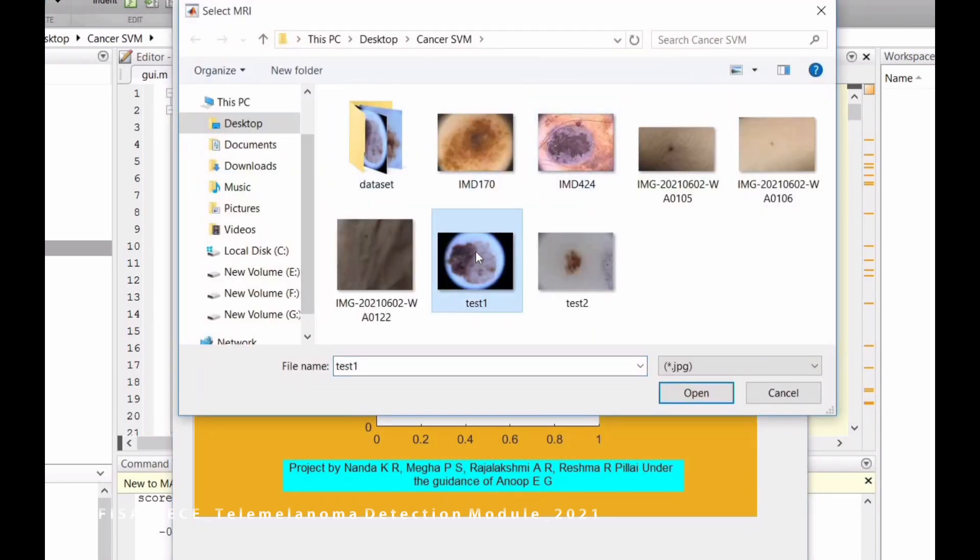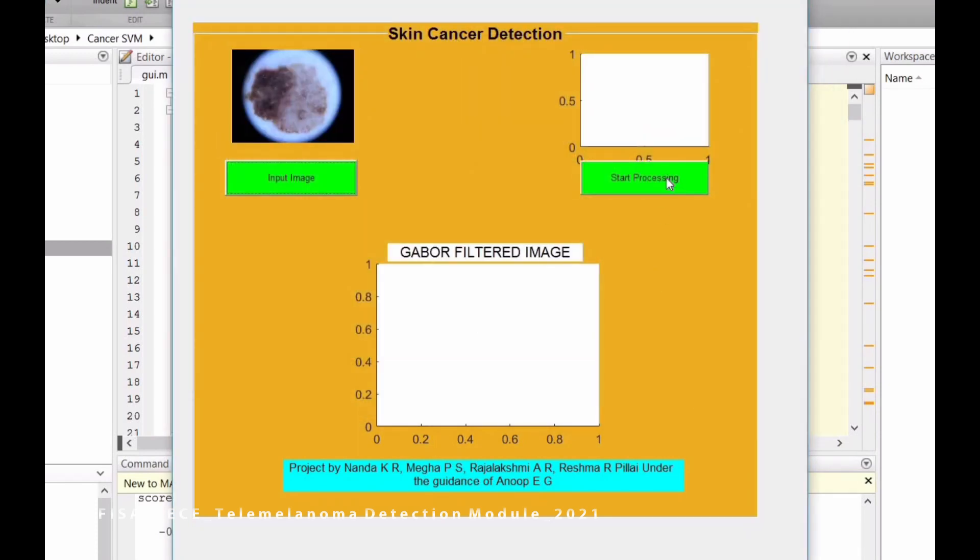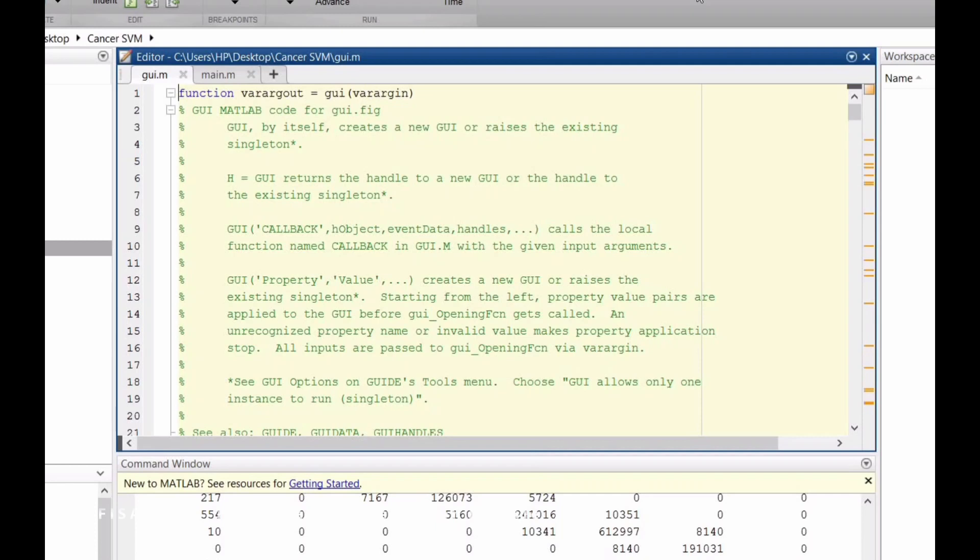A graphical interface is used. The skin image is taken as input to MATLAB. After completing pre-processing, segmentation, feature extraction, and classification using SVM classifier, the value of the input image is compared with the feature matrix of trained images. If the input image matches with the value of cancerous images in the trained set, then the input image is classified as melanoma.